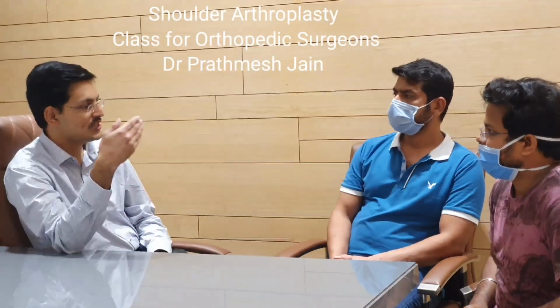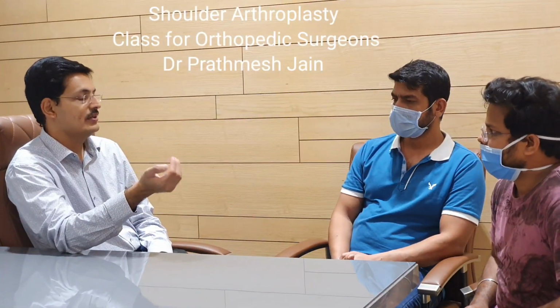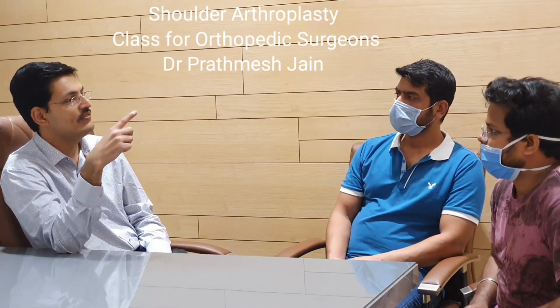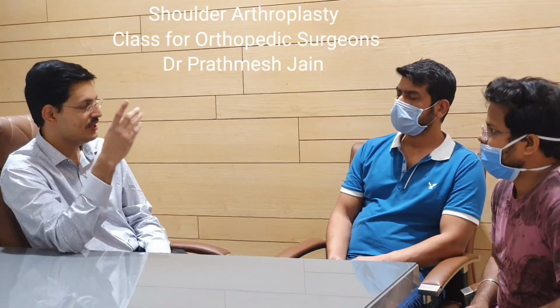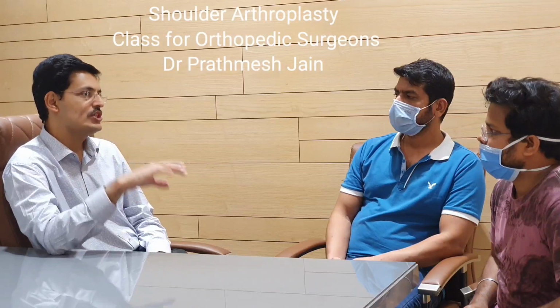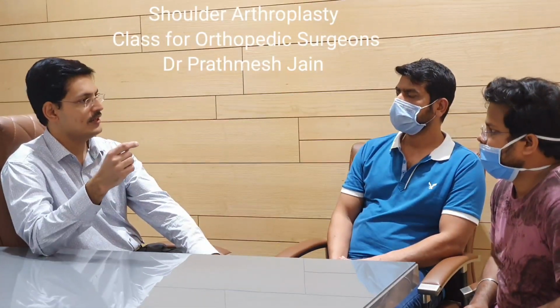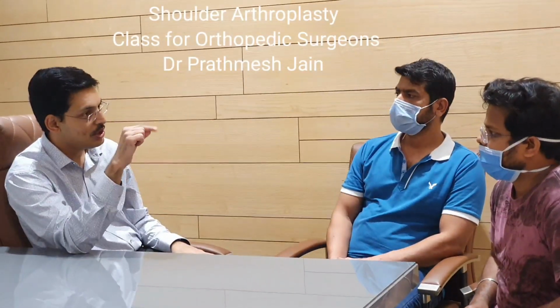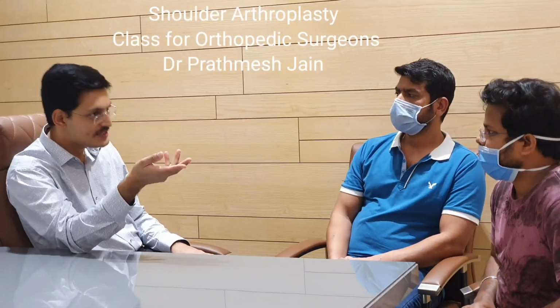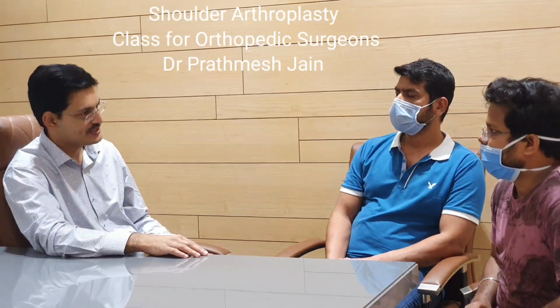So what is notching? Notching is basically wear on the inferior aspect of the glenoid, and this is because of the prosthesis. It is more with a 155-degree prosthesis, the olden design. With the newer design prosthesis, the chances of notching have reduced, and not all notching is symptomatic. If you see a little bit of notching on X-ray, it is basically wear or loss of bone at the inferior margin of the glenoid. That is commonly seen, but it is not always symptomatic, so you don't need to worry about it always.